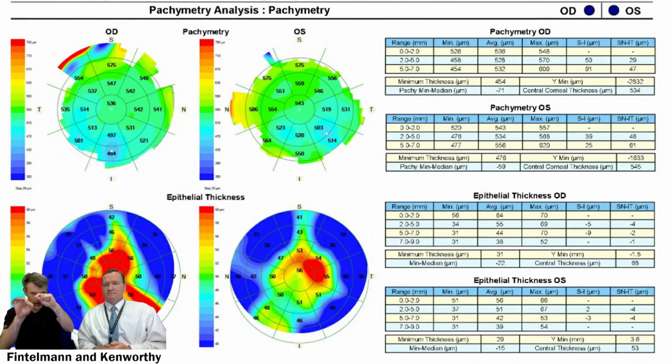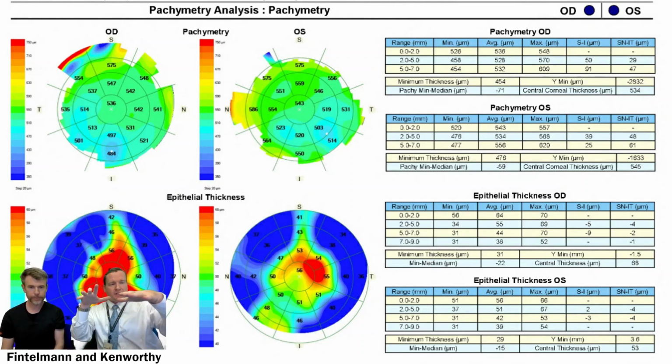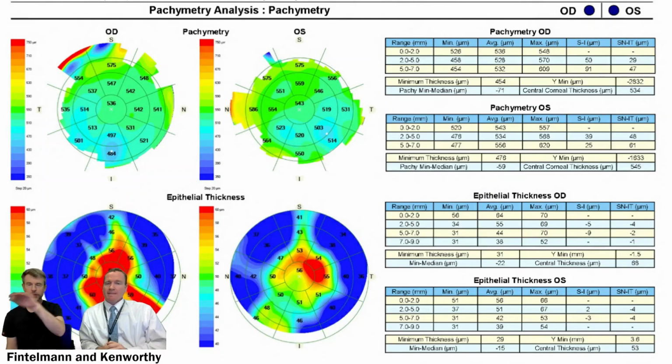You see kind of almost lines or dots. And people call this dryness, which it isn't, it's unstable epithelium. Just to repeat what you said, because I think it's so important, you are expecting, with a myopic RK, a thicker epithelium in the center, and to me that almost feels like a compensation where it's just trying to build up that tissue and smooth it out as much as it can to match the raised up peripheral RK scar tissue. I think that's fascinating. And almost try to match the curvature.